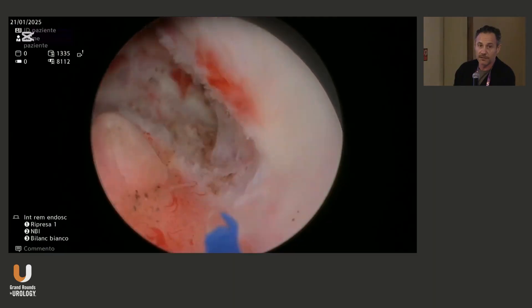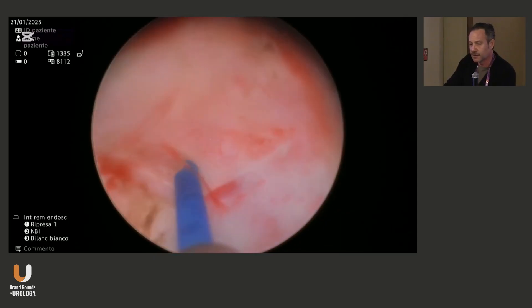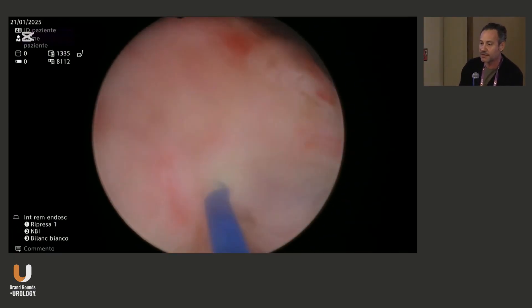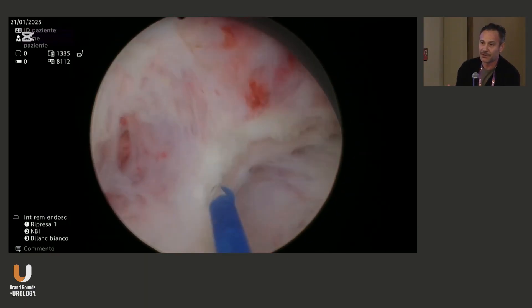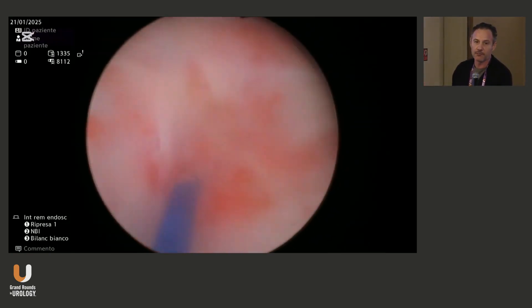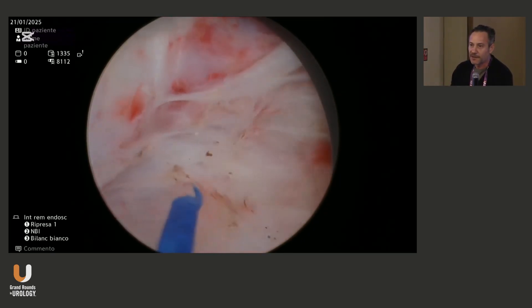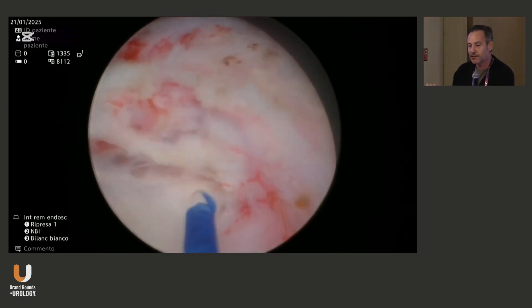Having a clear view of the bladder when morcellating is crucial to avoid complications. Now we're moving on the left lobe. I like to use the laser as a little finger — you can always go back to find the right plane if you get confused. Not all cases are like this easy one. You may find a 200-gram prostate with a beautiful plane, and sometimes you go to operate a 60-gram prostate thinking it will be fast, and then you have a lot of inflammation and you're not able to find the right plane. That's why I like to use gentle mechanical dissection.